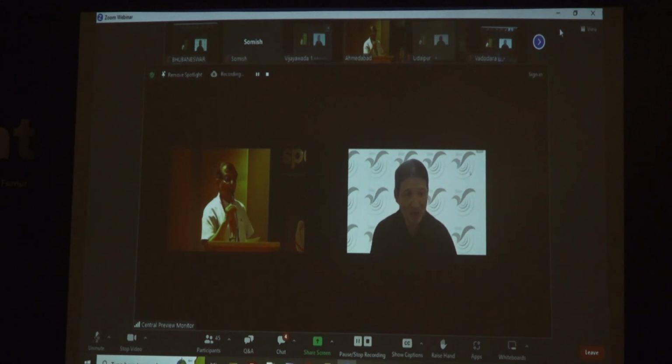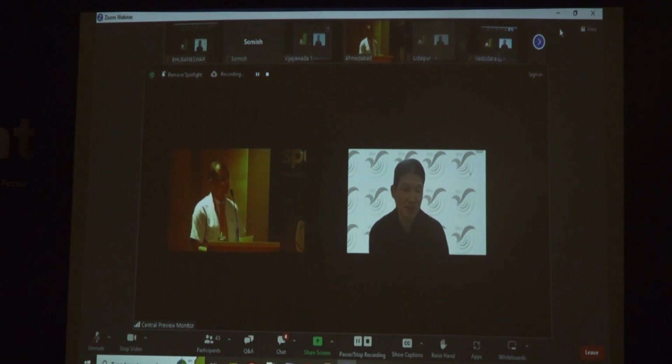But it'll be a lot easier because we do not have the penetration through the acetabulum, where we would have to think about using a total hip arthroplasty rather than the bipolar head arthroplasty. Like I've shown you one case that did it. So cement augmentation in trouble cases, I think, could really help your practice and also your patient.